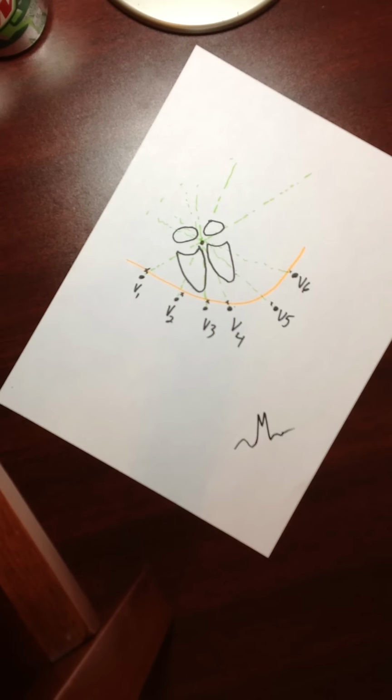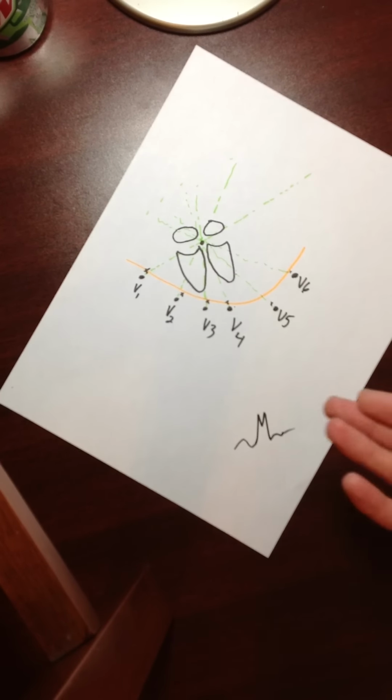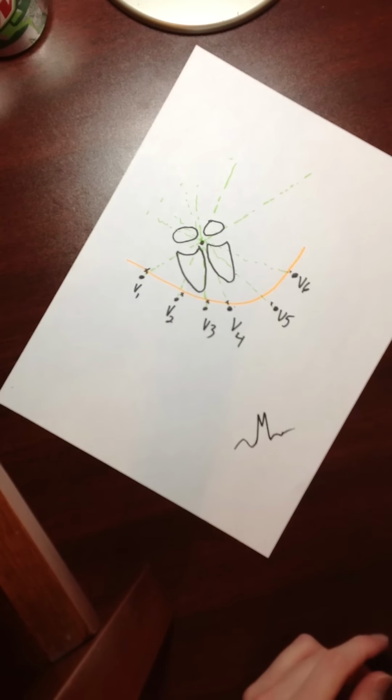So I could see him asking a test question where he says, you know, you're a resident and your attending says everything looks normal except in V5. What would that probably indicate, just based on that information alone? Well, I think reasonably it would say that there'd be something wrong with the left part of the heart. Okay. Now, how does this actually correlate?